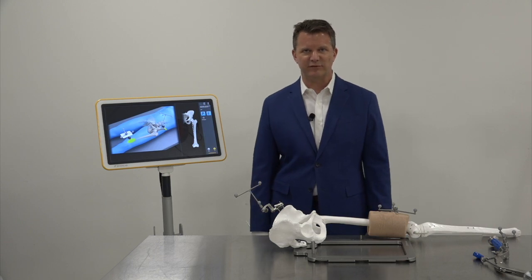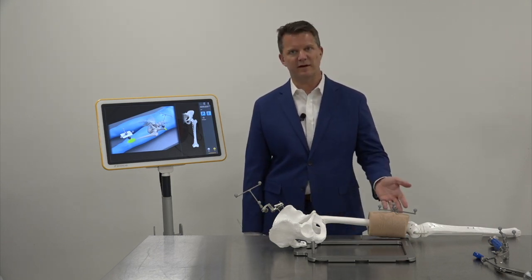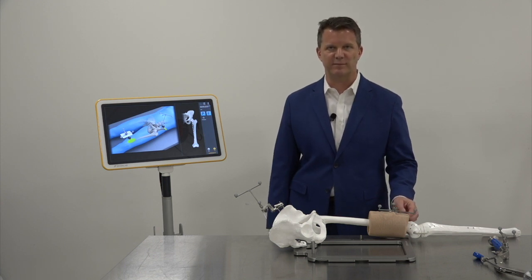In surgery, I've placed two reference arrays, one on the iliac crest of the patient and another non-invasive reference array on the distal end of the femur. The pinless reference array is purely used for orientation of the femur and is not used to take measurements.